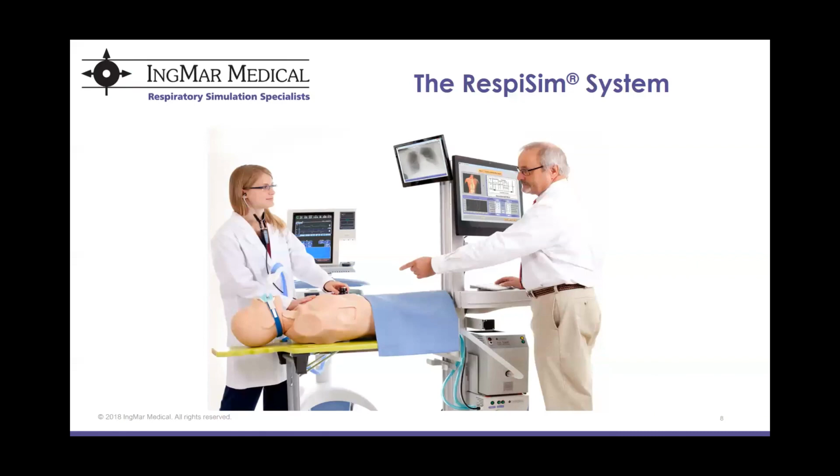We have another question about the mannequin. It says, on your mannequin, will it actually detect leaks with non-invasive? So your non-invasive ventilator, if there's a leak, it should leak. The mannequin does not detect a leak. It would have to rely on the ventilator as we do in real life.